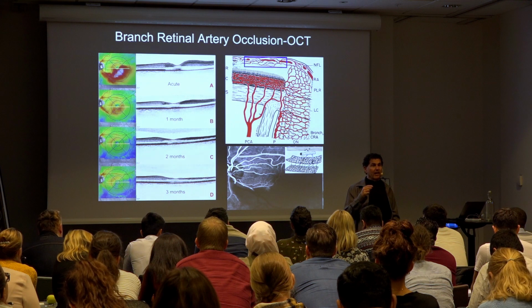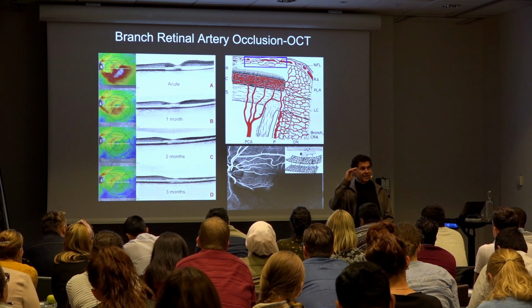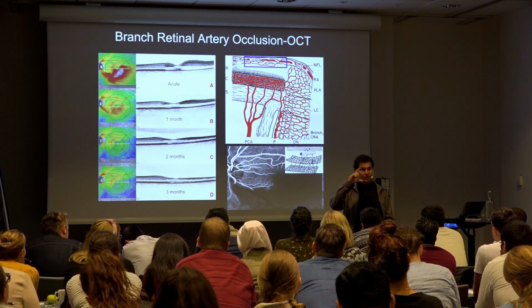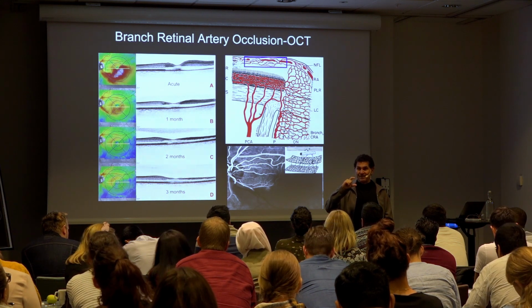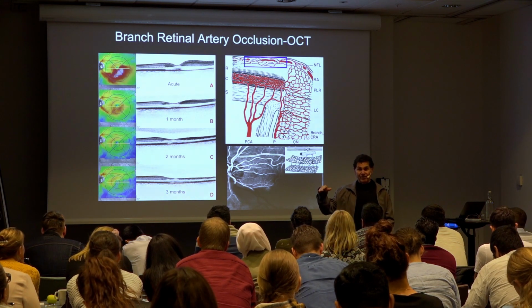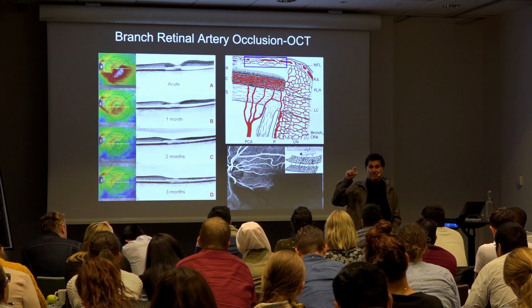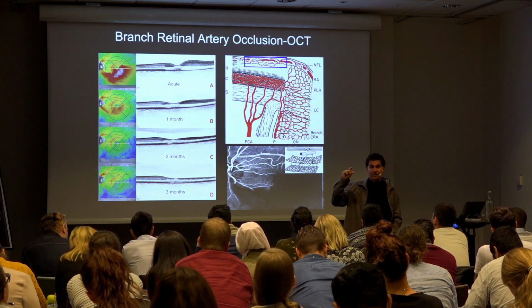So two things are going to help you. Looking at the total retinal thickness, because since you're losing RNFL, ganglion cell, and bipolar cell layer, the total thickness is going to be much thinner in an artery occlusion after the atrophy has occurred. But in an optic neuropathy, you'll still get thinning, but not as much because you're losing two of the three layers, not all three.